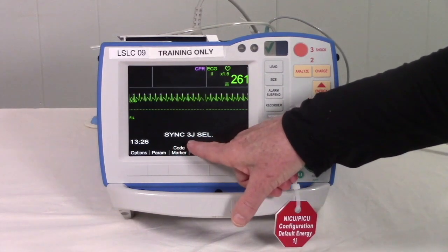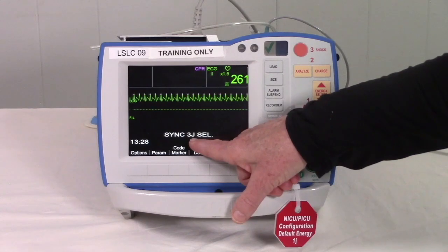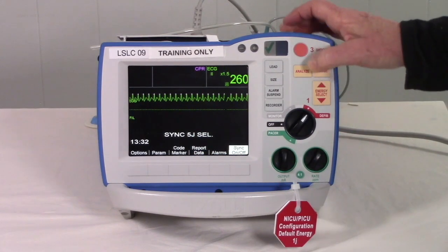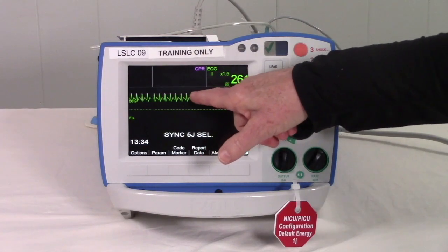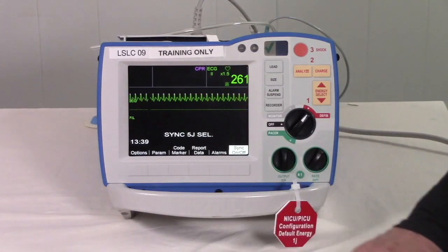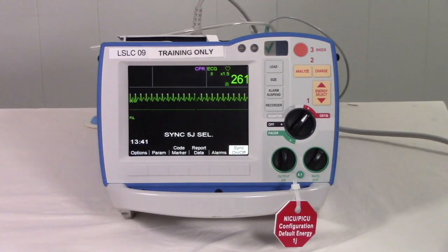Put it back into sync mode in case it's needed again. If we're going to increase, we'll go up to 1 joule per kilo — for a 5 kilo baby, that would be 5 joules. Confirm you are on the right waveform, and now we're ready to use this again in synchronized cardioversion mode.